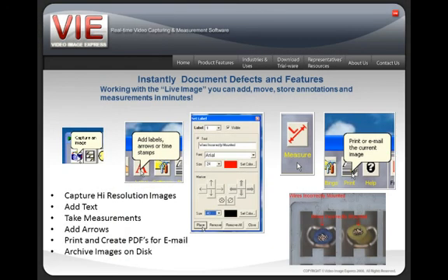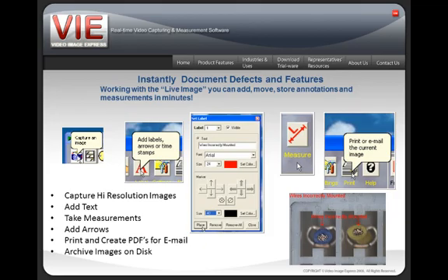The process of adding markups or annotations to your image couldn't be simpler. In seconds you can capture high-resolution images, add text, take measurements, add arrows, and store the measurement results on the image. You may now create PDFs quickly and easily for email and communication.